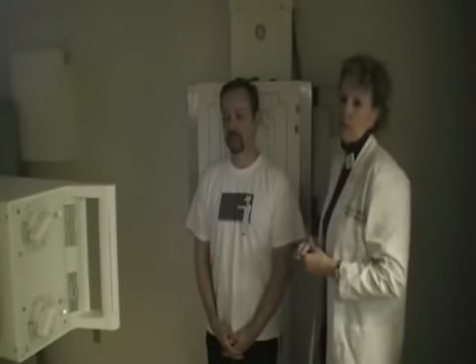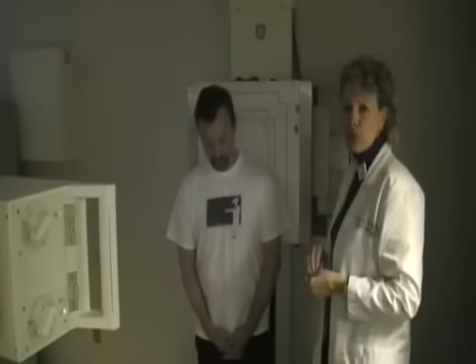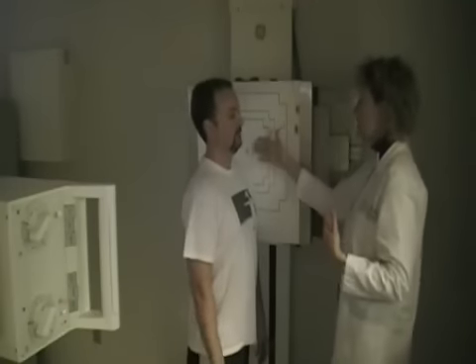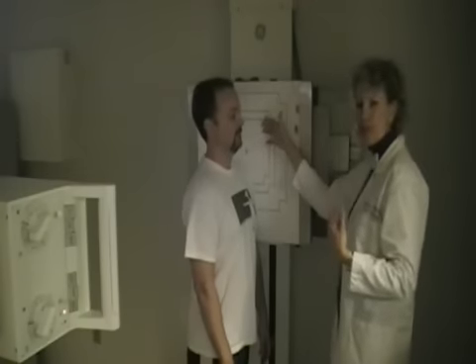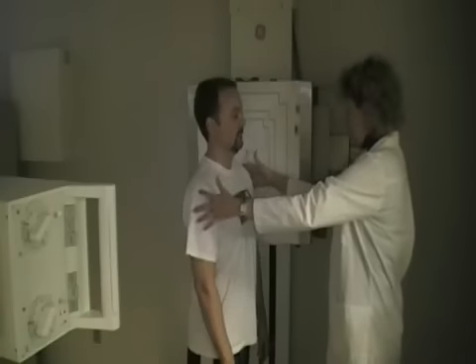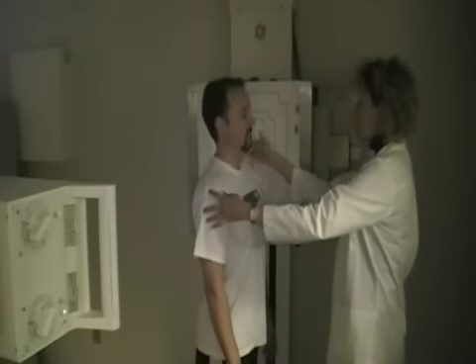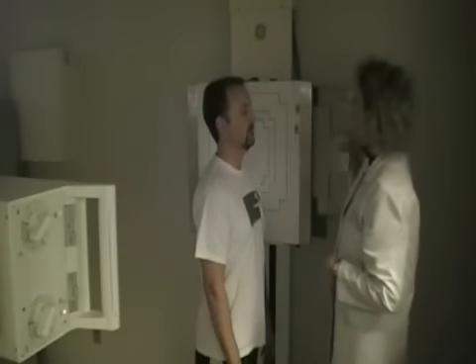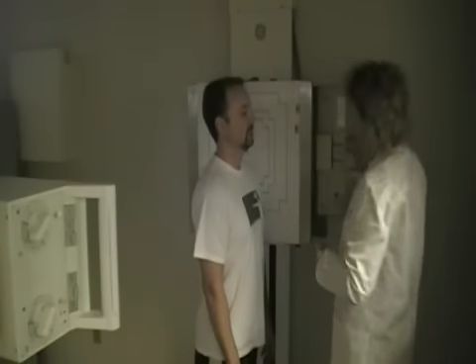Okay, we're going to be doing the cervical spine imaging, and what I'm going to show you is typically the routine cervical spine that you'll be experiencing out in clinical site. First, I'm going to start with the lateral C-spine on an ambulatory patient, and you have the patient turned sideways so that the left shoulder is touching up against the board. Have them step towards you just a little bit so that you can get the neck centered to the center cell on the Bucky tray.